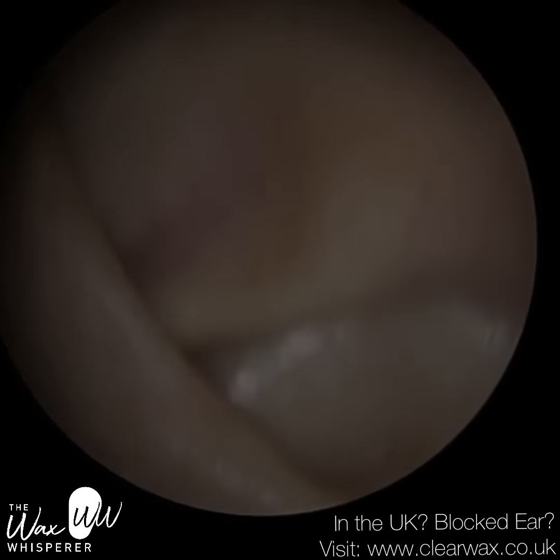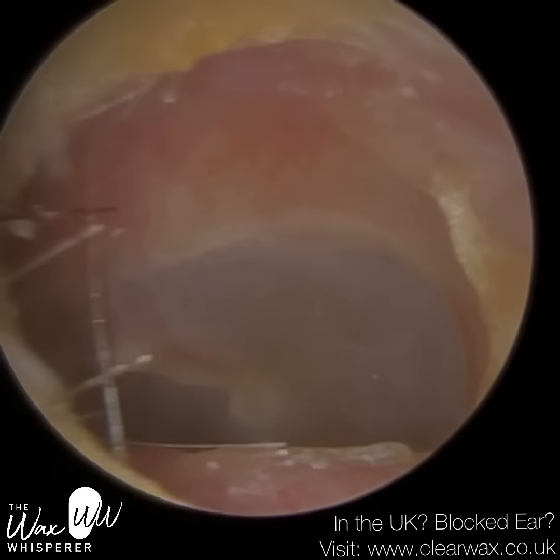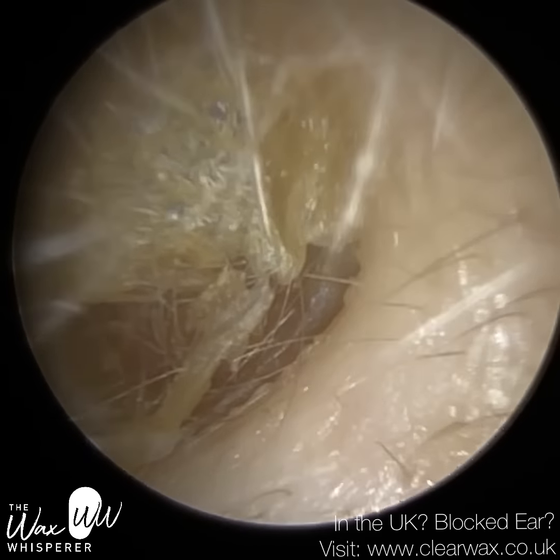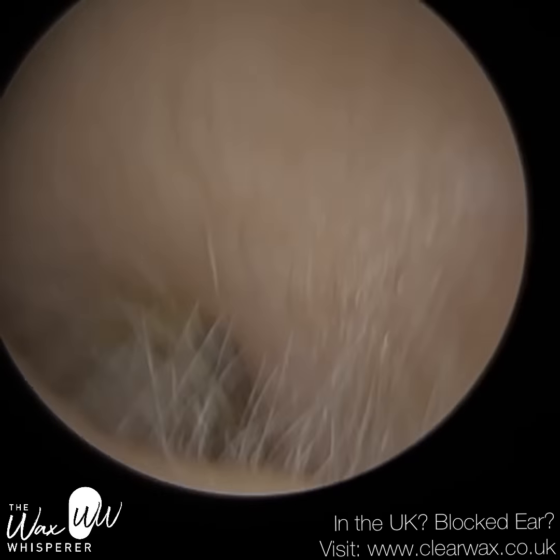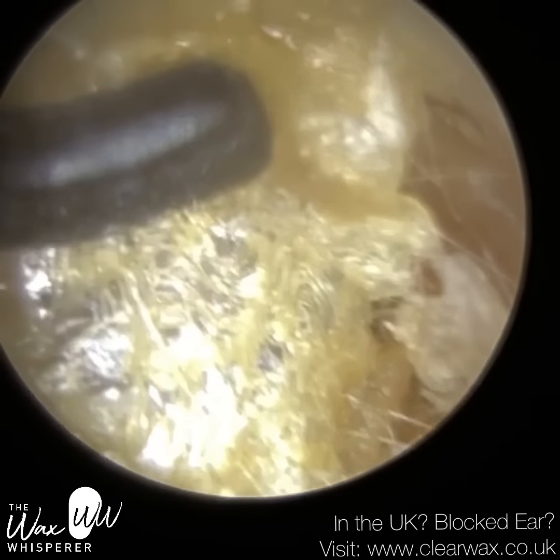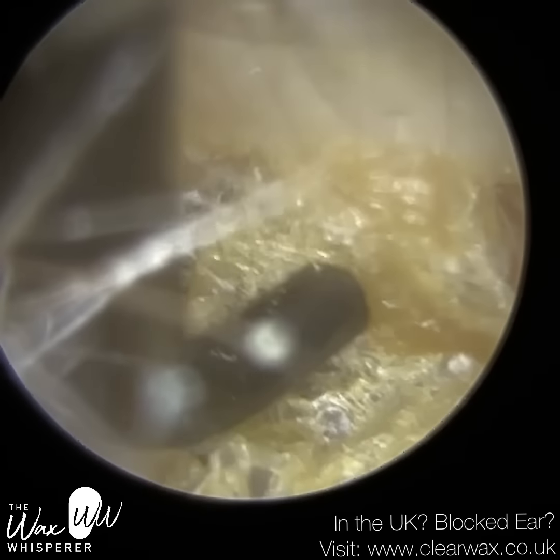I then rotated the hook clockwise 90 degrees, which meant the tip of the St. Bart's ear hook got embedded within the core of the keratin and wax plug. So this is the same patient, but this is their right ear. So the previous one, of course, was their left.